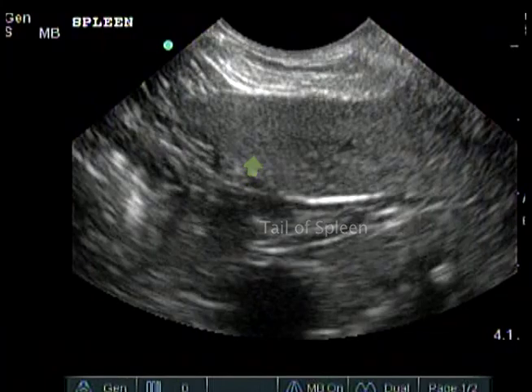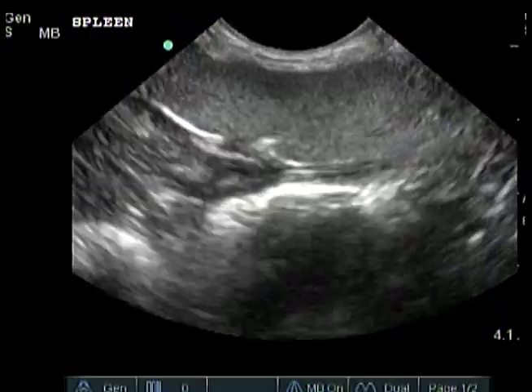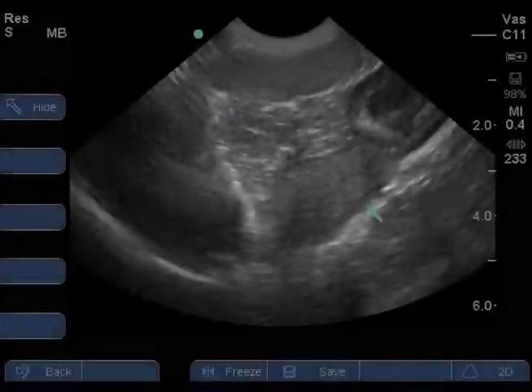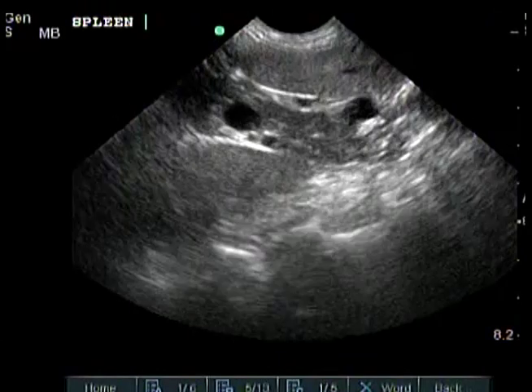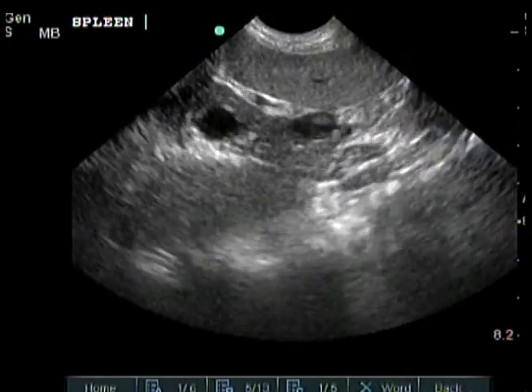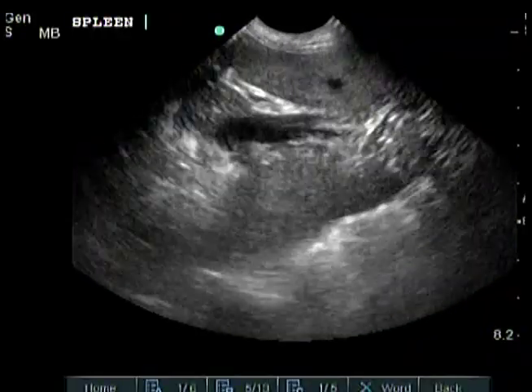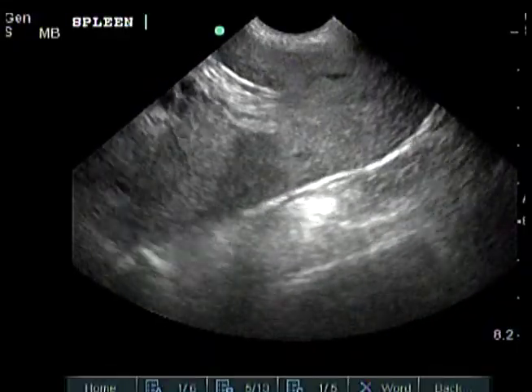The tail of the spleen is not directly attached to any organ and can be located almost anywhere in the abdomen. It is a common error for beginners to identify part of a folded spleen as a tumor. The ultrasound beam crosses two parts of a folded spleen. Move the beam by sliding the transducer to follow the spleen till the two parts connect.